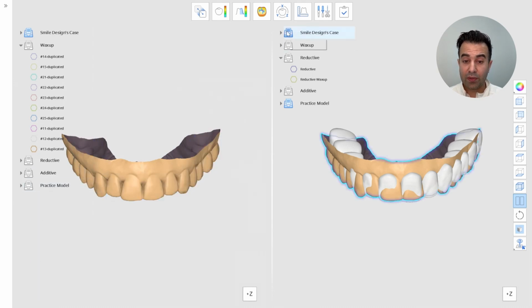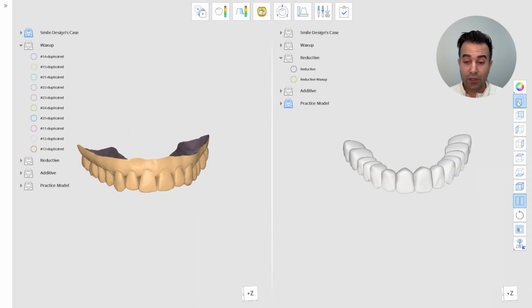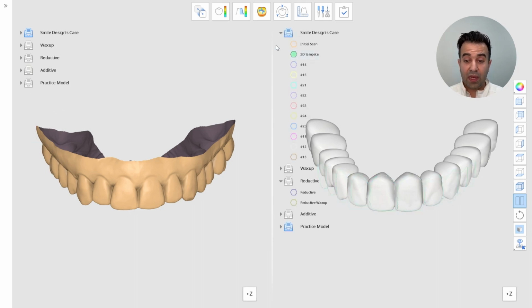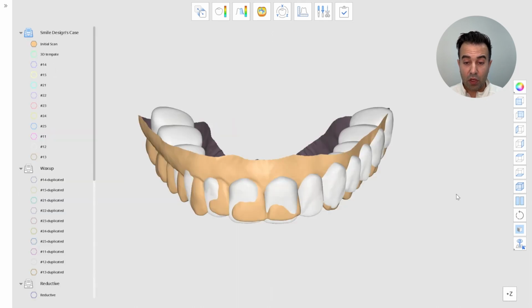And of course we can use the other app, which is a model builder app, in order to allow you to print that 3D mesh. So model builder app is another app on the MEDIT link that would allow you to convert a 3D mesh into a 3D printable object.